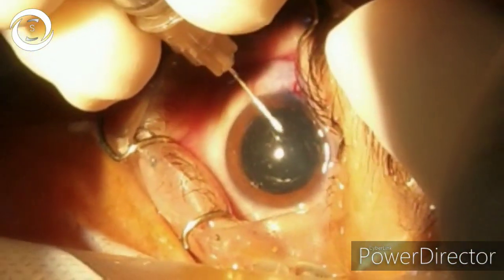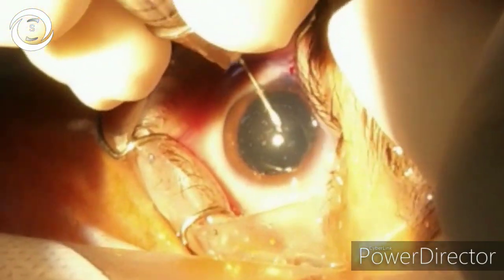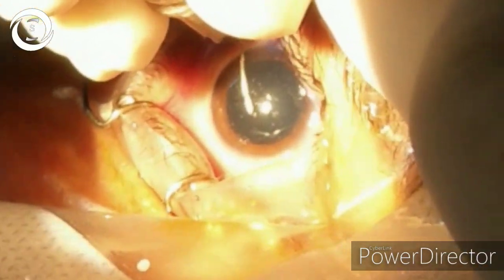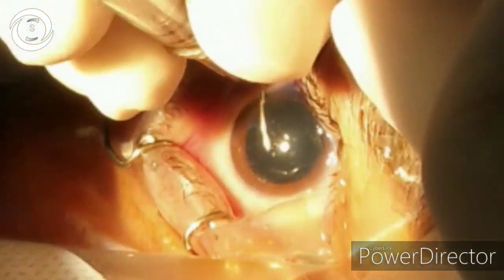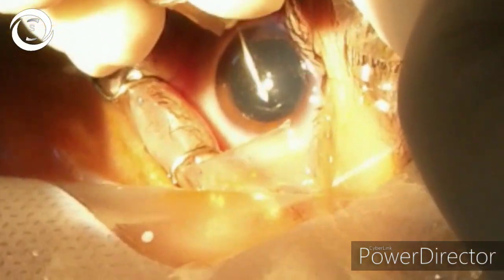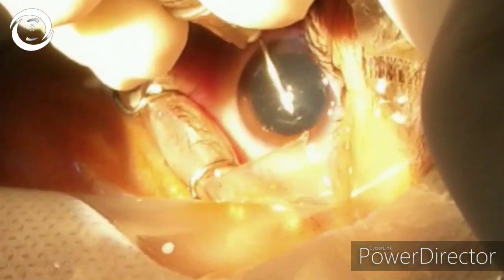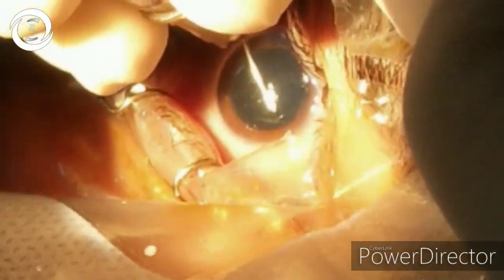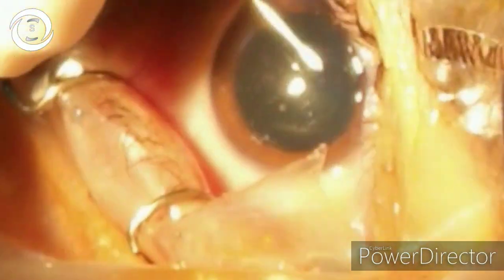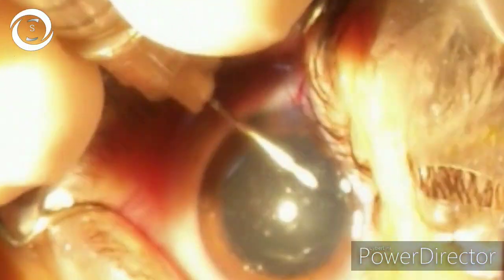Tell the patient to look towards the light. Very slowly and gently proceed with the capsulorhexis. You should make sure that you don't complicate the case — make a circular, smooth capsulorhexis.